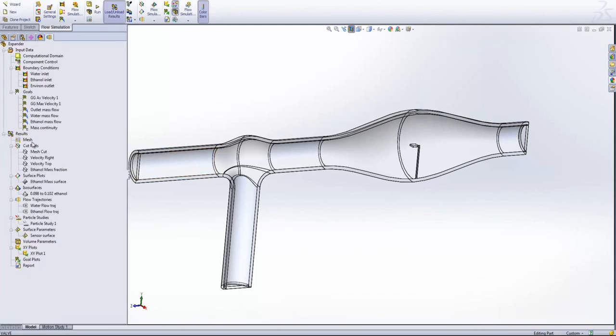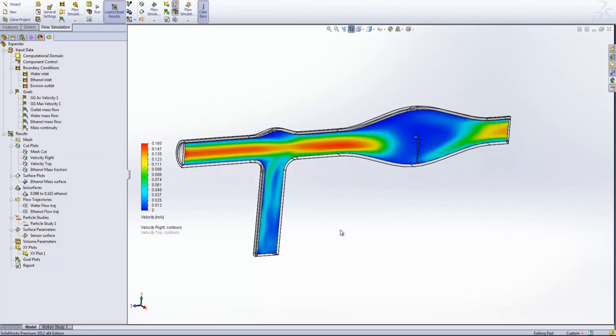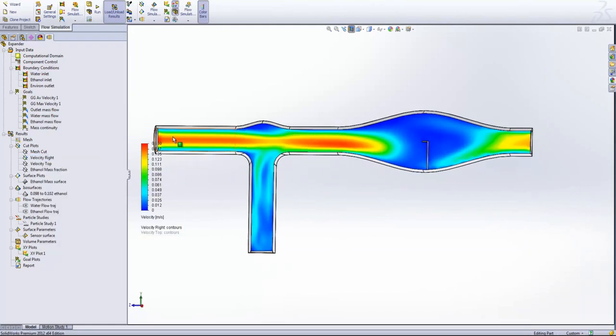So here I've already run the study, and you'll see I've named all of our results tools as well. So we'll have a look at, say, the velocity from the right hand side, and we'll see that we've still got that water jet structure upstream of the joint, but following from that joint, as we move into the expanded region, you'll see that the flow is significantly slowing down, which is exactly what we're after.